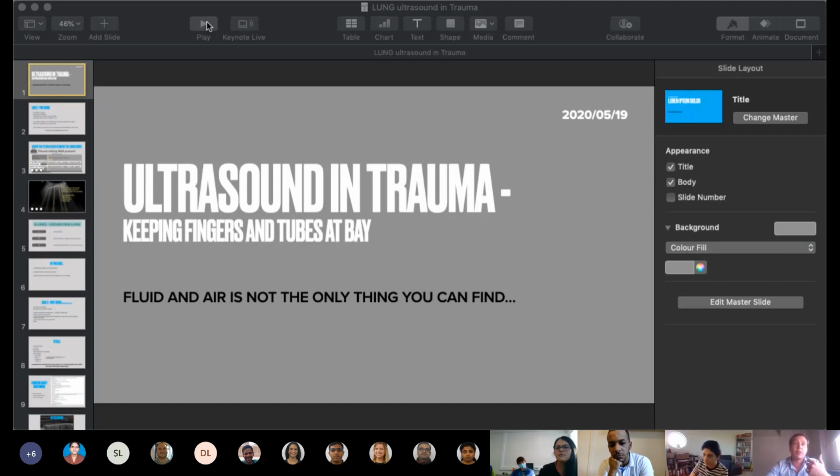So once you choose the preset modes, and in JR they've got the Mindray TE7, which is quite a good machine, you can see each of the software presets you choose gives a different image quality. And that image quality is influenced by filters and post-image processing. Now, that post-image processing can influence the pleural sliding and the vision you get. It's almost like slowing it down, where if you're really struggling in a situation and you change your software to, the one I used in the end was lung, then it takes away all those filters.